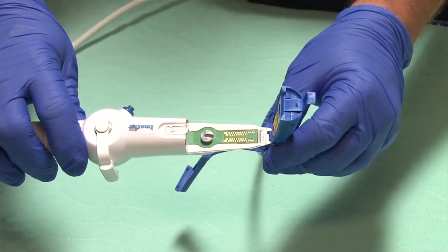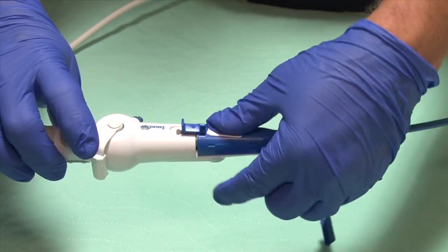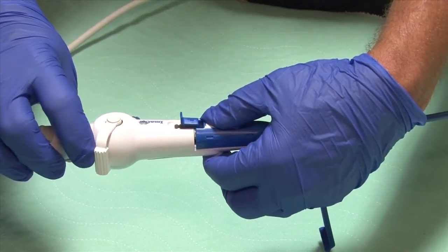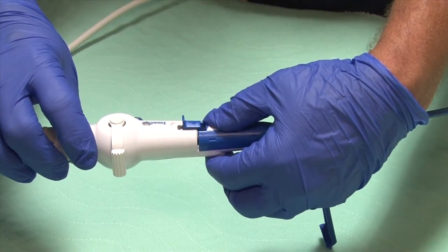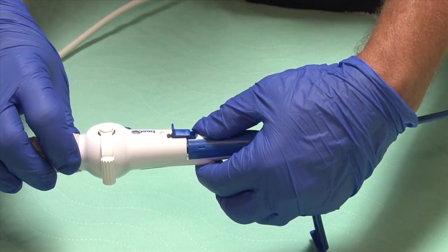Once I put the cartridge on the handle, I want to make sure that lines up and just gently move the lever until I hear a click. Once you hear the click, you know that this has joined well and is secure with the handle.